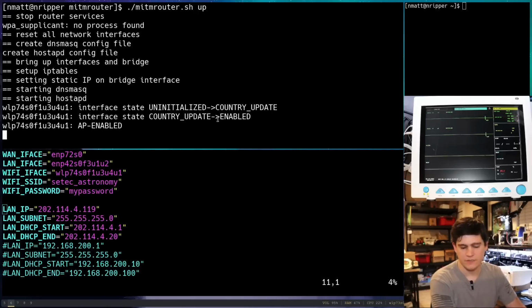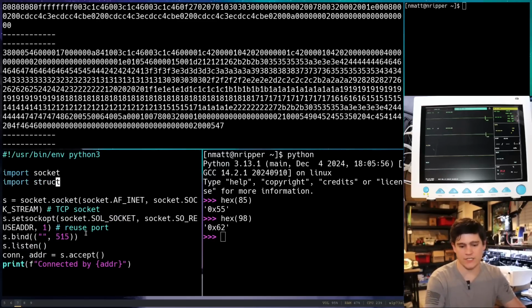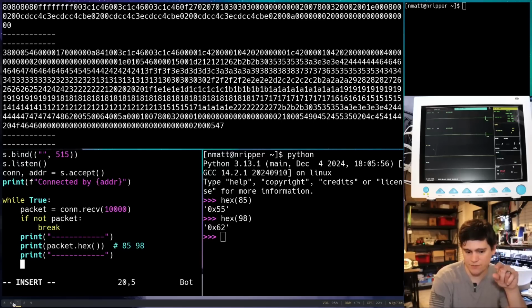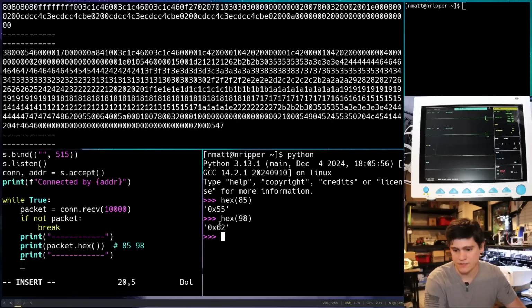So what we're going to do is come over to our script and start adding some cool little stuff to our Python script. First we need to go up here and import the struct library. That's going to help us do a bunch of data parsing over multi-byte data types. And so first, we have to remember what is the order. Which one of them was first? The 62 was first. So that is the higher number, which is, no, I actually got that messed up. No. The 62 is first. 62 is this number, which is the pulse ox.